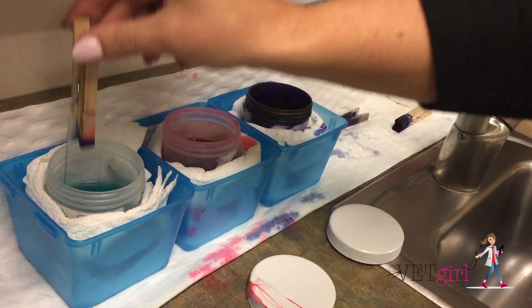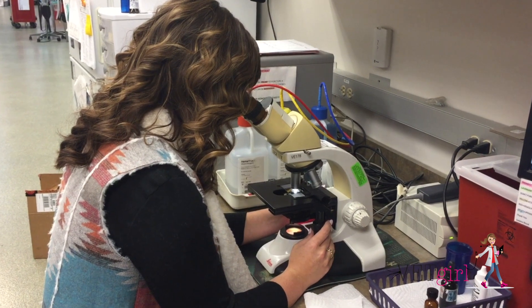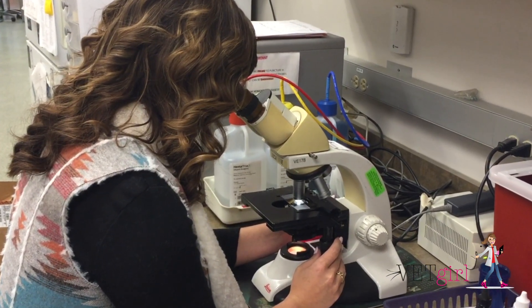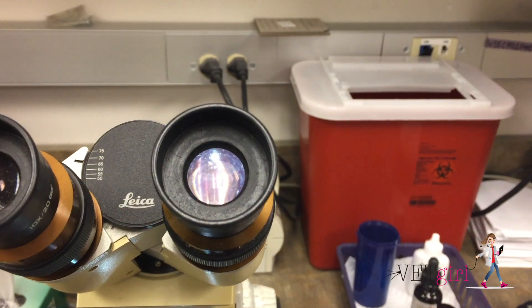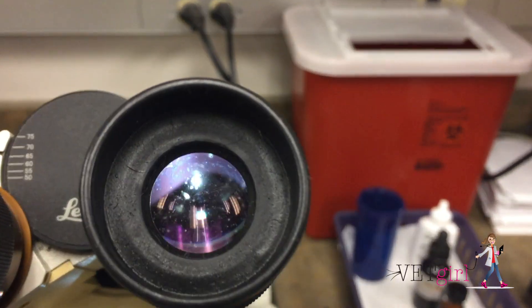Vet Girl's tip: do not use cotton tip applicators. While they collect the sample well, they do not allow it to stick to the glass slide, and thus the samples obtained are generally of poor quality.